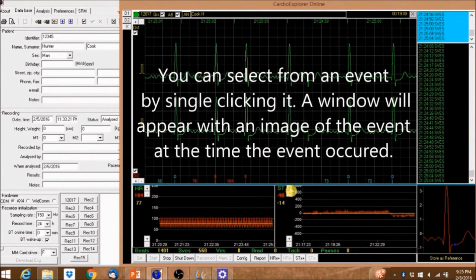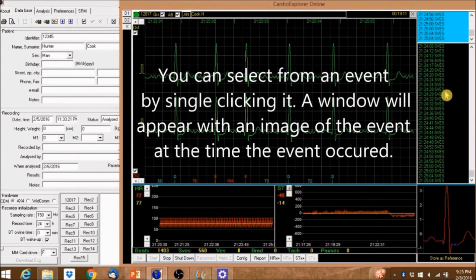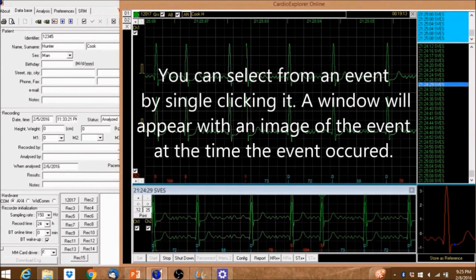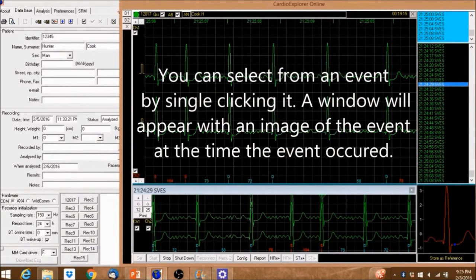You can select from an event by single-clicking it. A window will appear with an image of the event at the time the event occurred.